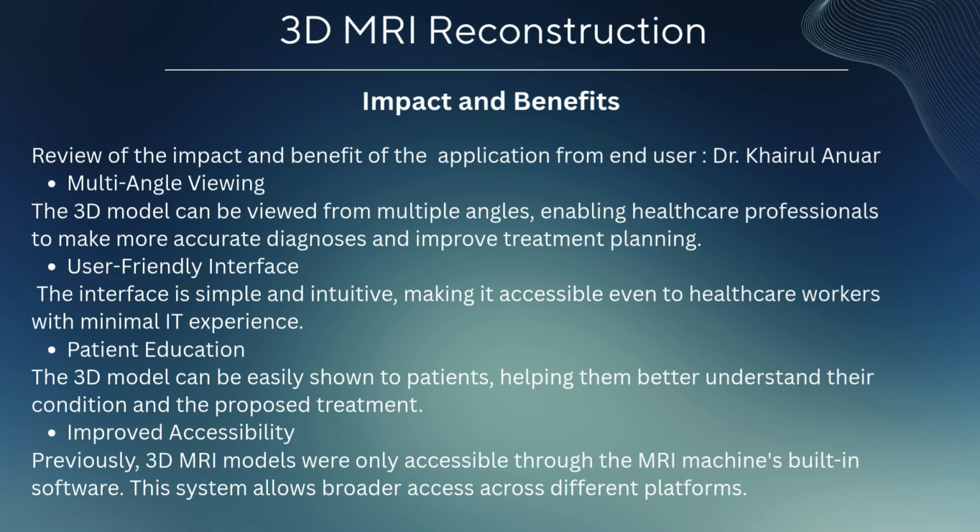And last but not least, he emphasized improved accessibility. Previously, 3D MRI models could only be accessed through the MRI machine's built-in software. Our solution breaks that limitation, making 3D visualization available on regular desktop systems across various settings. Overall, the feedback confirms that this application doesn't just have technical merit, it also meets real clinical needs and opens up new entrepreneurial opportunities in both the medical and educational fields.